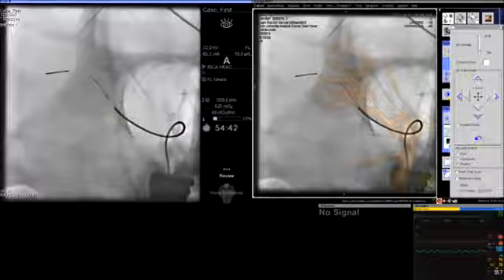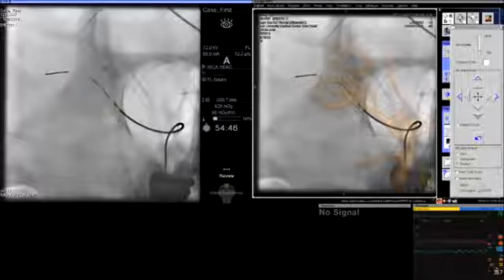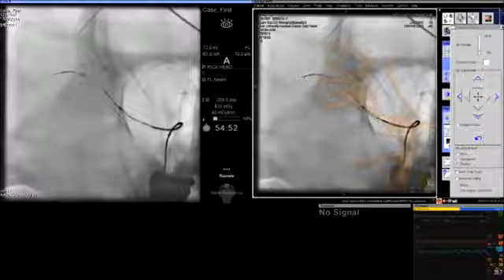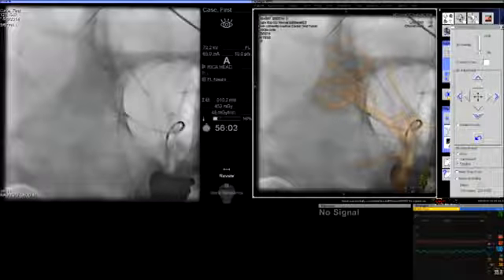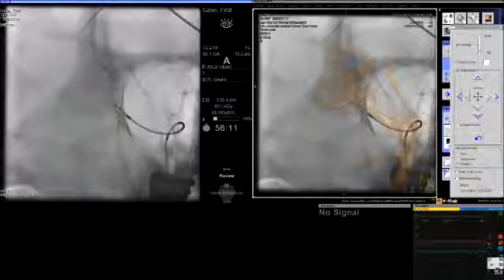Now, once you deploy the stent, you see that we were careful to have a very good purchase of the middle cerebral artery M2 segment and very little on the M1 segment. That was done to avoid placing multiple devices for a long segment of overlapping into the M1. Once we deploy the first, the microcatheter remains in position, and you use the Synchro 14 wire now to catheterize the second branch of the bifurcation.